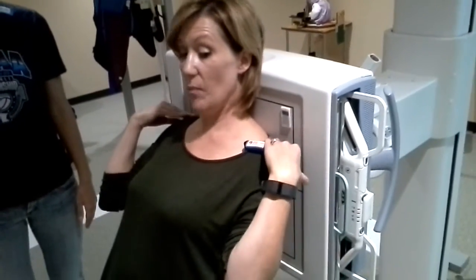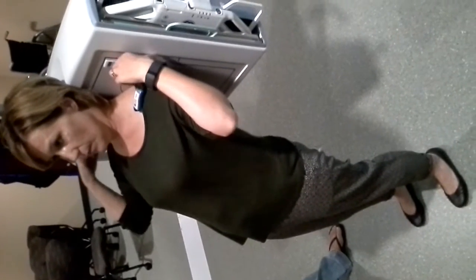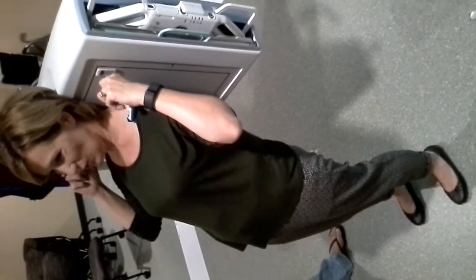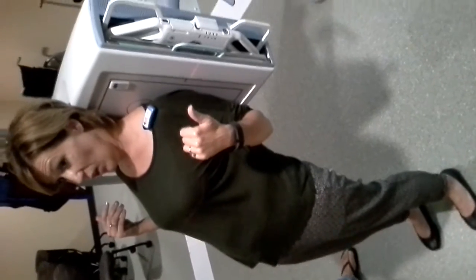So then once they're back, now see how it lowered my shoulders down? And then I would evaluate if I've got that up high enough behind their back. Okay, so I would say 2 to 3 inches. Like I say, 3 inches a lot of times is a little too much. Okay, so how does it look? It looks a little too much. Yeah. A little over 3?